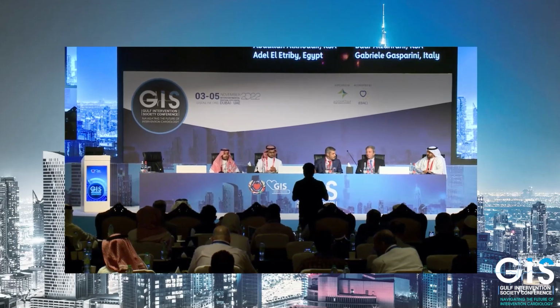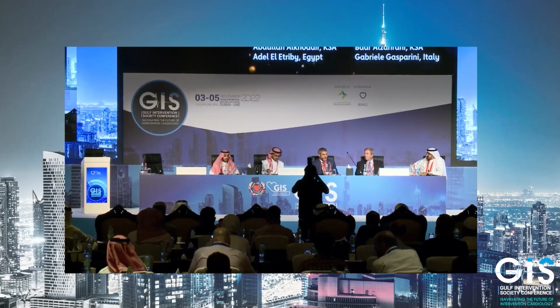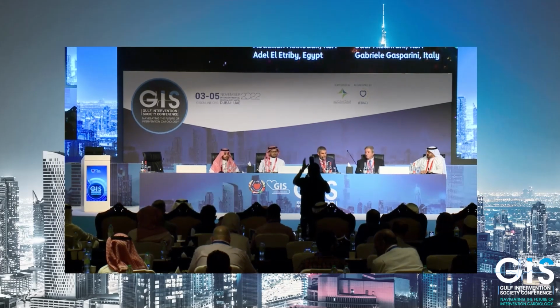So let's start with Dr. Gabriel. Gabriel, when you hear about left main intervention, we saw some lectures today. So what's the most important in your mind? Yeah, first of all, when we have to deal with left main intervention, independently of the involvement of the bifurcation, is to consider use of imaging.